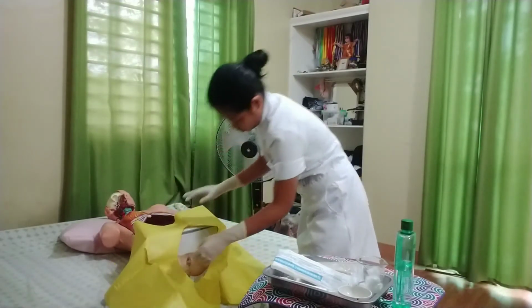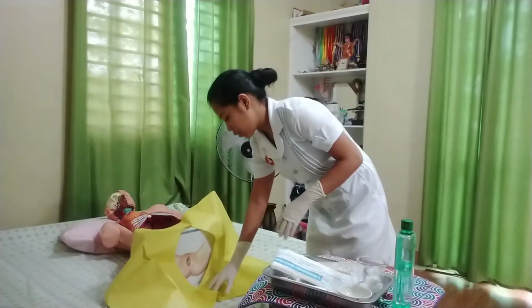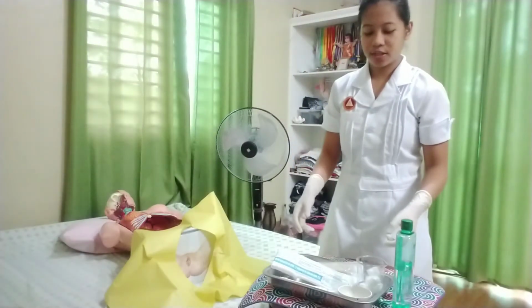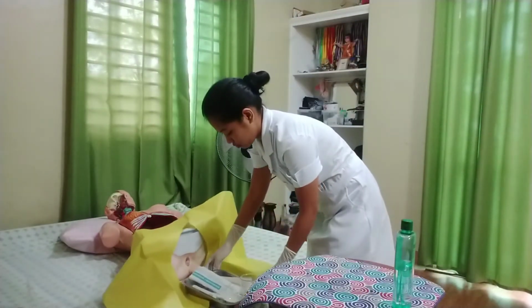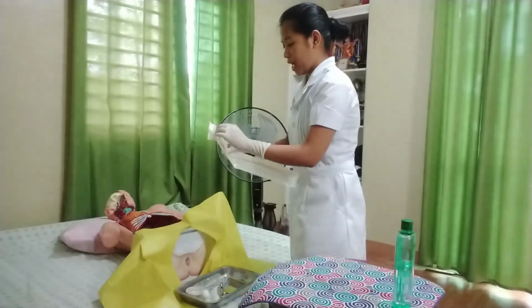Now that it is done, I will place the sterile tray over the drape between my client's thighs. And then I will open all the supplies.